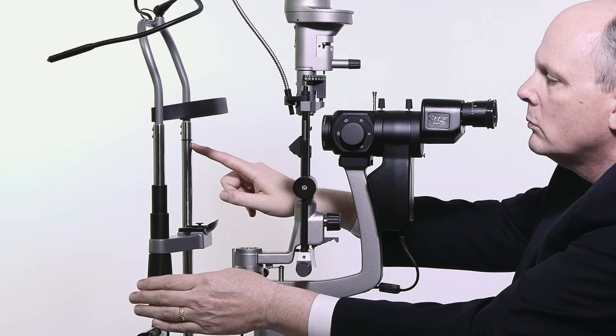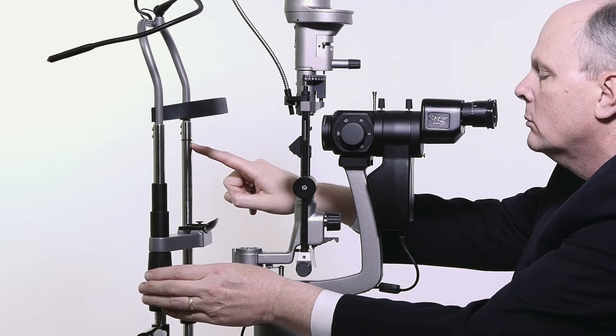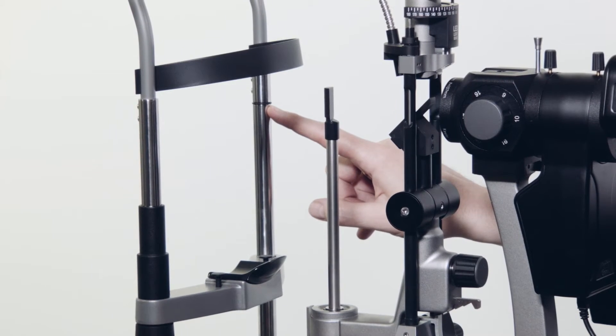Adjust the chin rest height so that the patient's eyes are level with the height mark on the chin rest support.